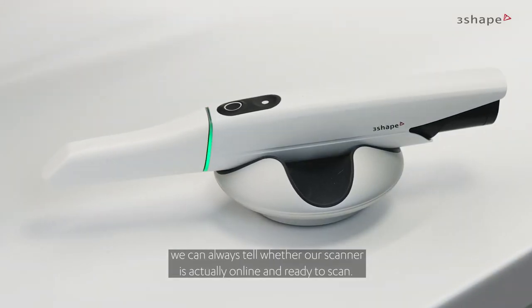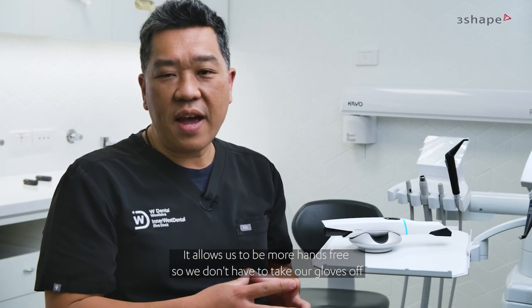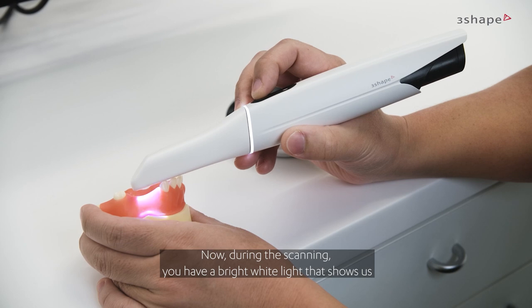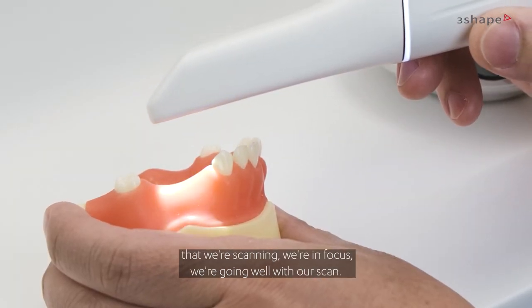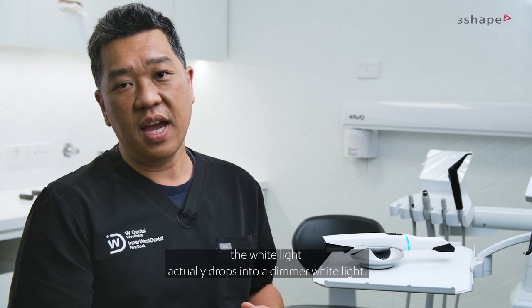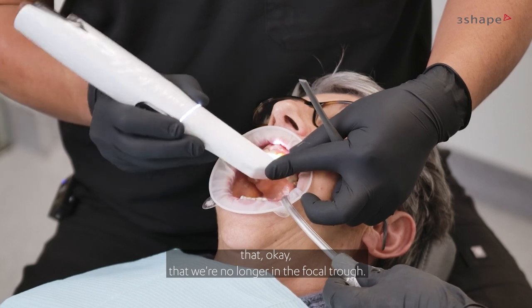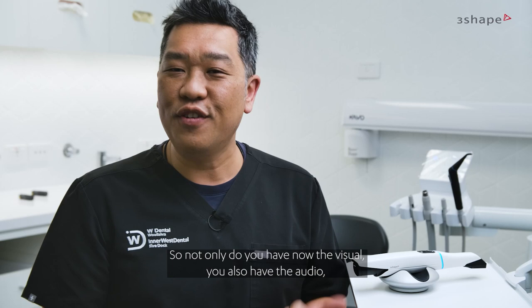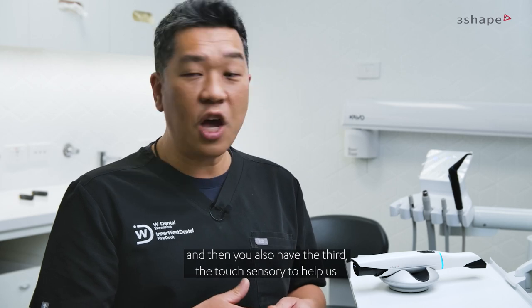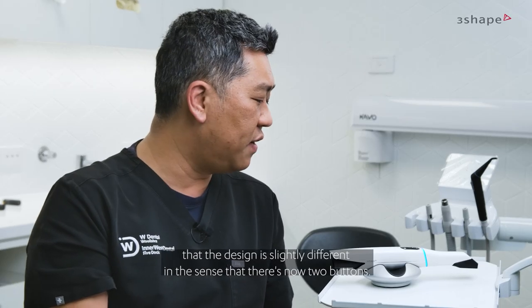When we talk about the LED light, we can always tell whether our scanner is online and ready to scan. It allows us to be more hands-free — we don't have to take our gloves off to check whether the scanner is online. During scanning, a bright white light shows us that we're scanning, in focus, and going well. As soon as it's out of focus, the white light drops to a dimmer white light and you also get a haptic vibration to tell you that you're no longer in the focal trough. So not only do you have the visual, you also have the audio, and then the touch sensory to help make scanning more effortless.